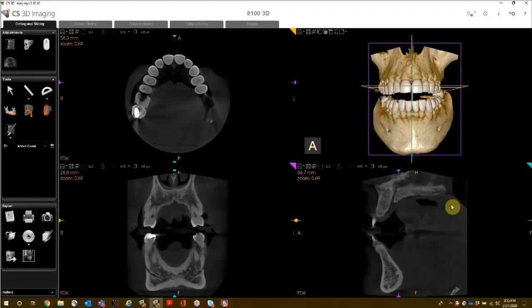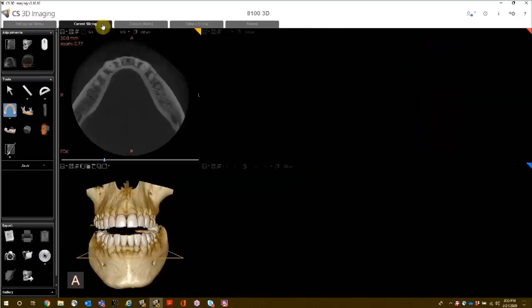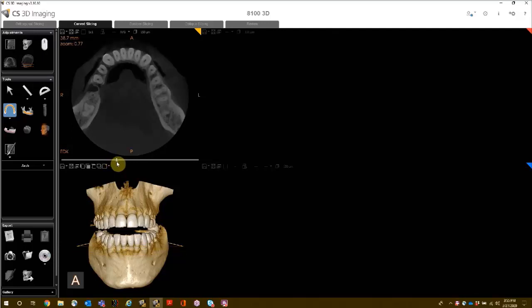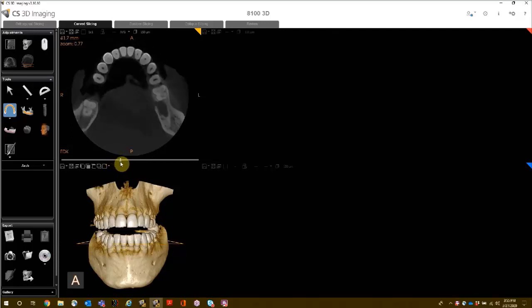Creating a reconstructed panoramic image. To create a panoramic image, first open your volume in the Curve Slicing tab. Find your axial slice slider bar and align your axial view until you can see the full arch, including the teeth.